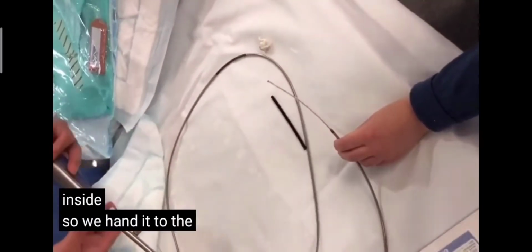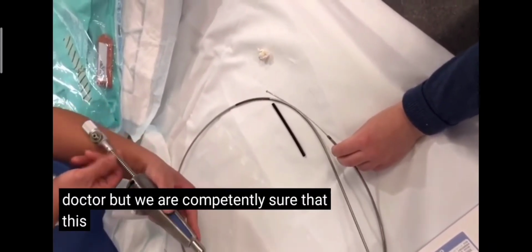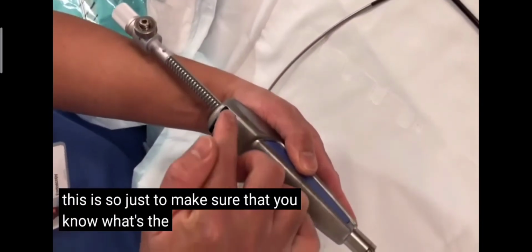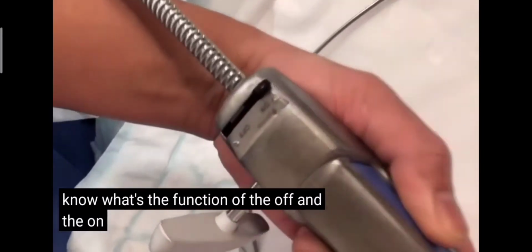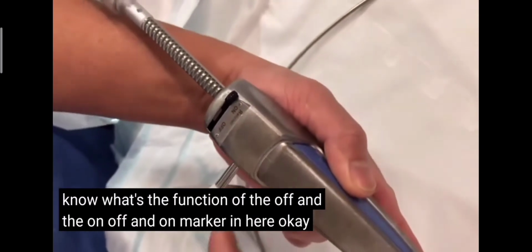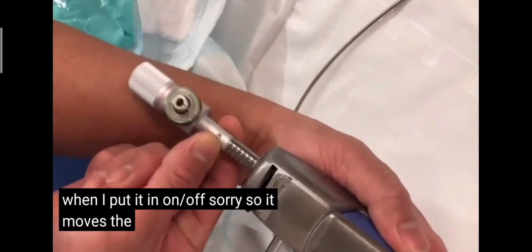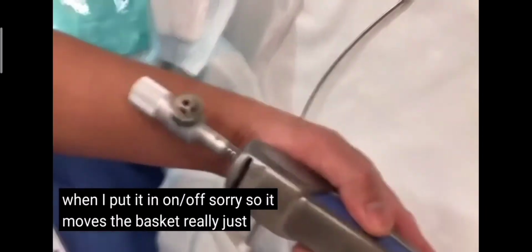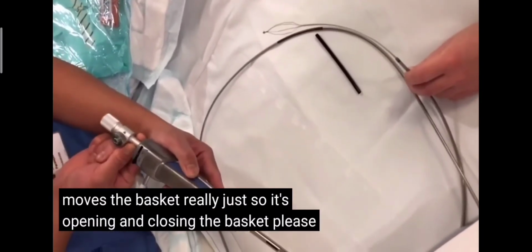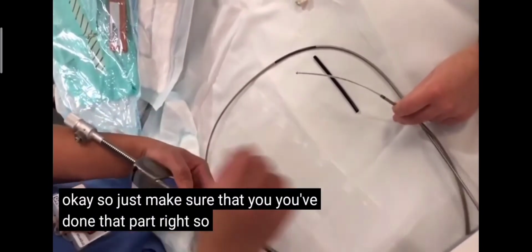So we hand it to the clinician or to the doctor, but we are confidently sure that this works. Just to make sure that you know the function of the off and on marker in here. When I put it on, off, sorry, it moves the basket freely. It's opening and closing the basket freely. Just make sure that you've done that part, right? So give it to the doctor.